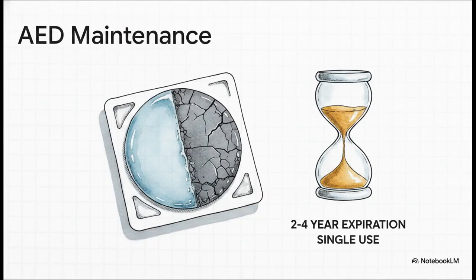First off, AED pads are strictly single use. Once you stick them on, they cannot be reused. Full stop. Furthermore, they expire every 2 to 4 years. And this isn't just some arbitrary date the manufacturer slapped on the box. The crucial adhesive gel actually dries out over time. If that gel is dry, the pad cannot securely adhere to the skin, which basically prevents the device from reading the heart rhythm, or worse, delivering a shock without causing serious burns.